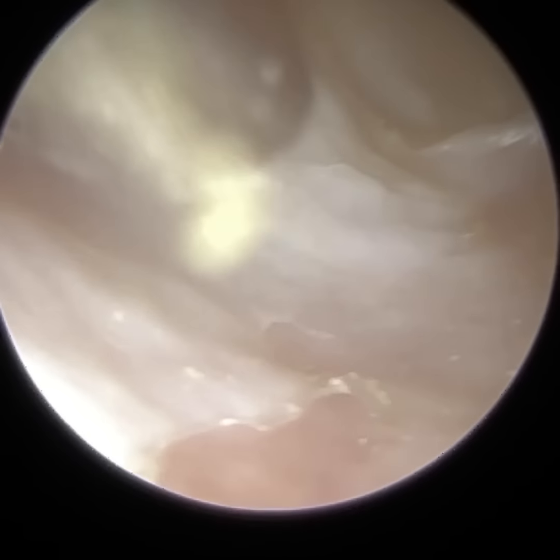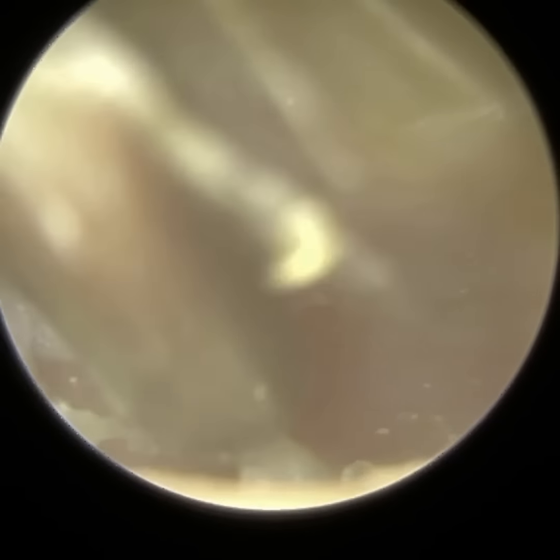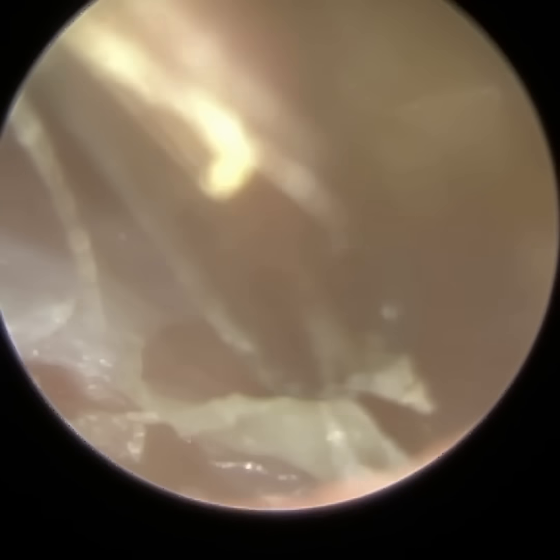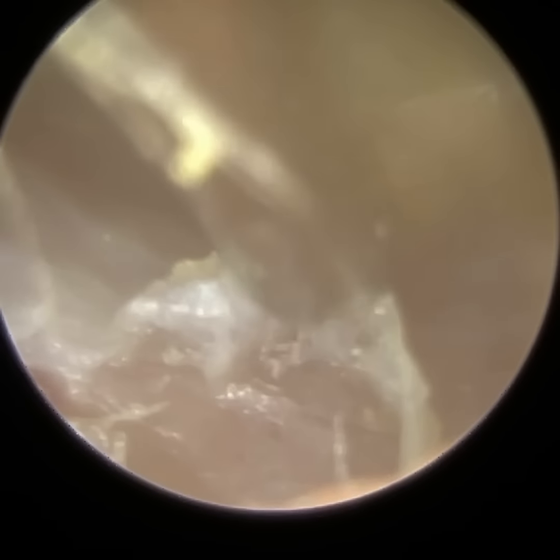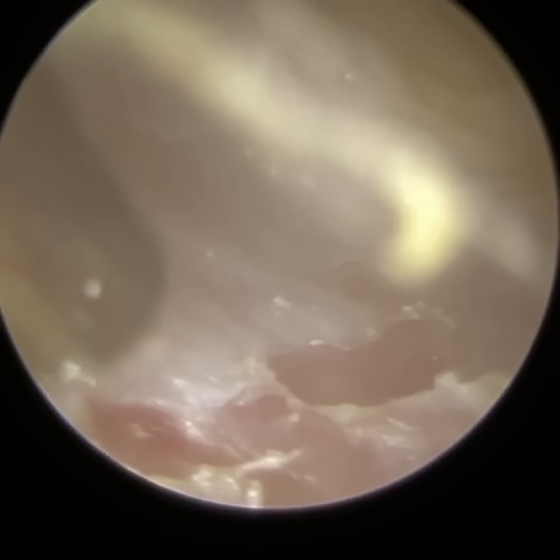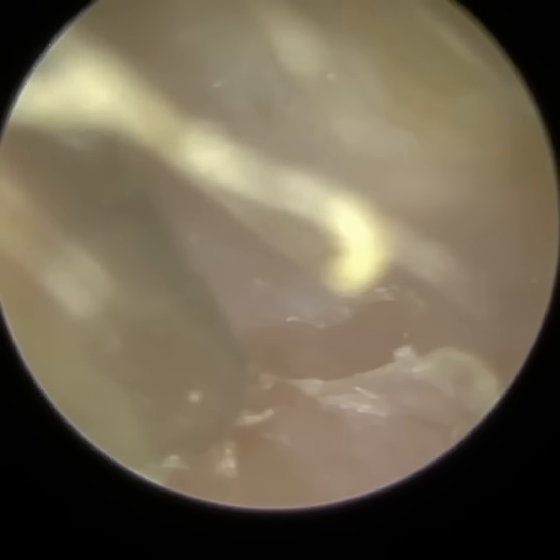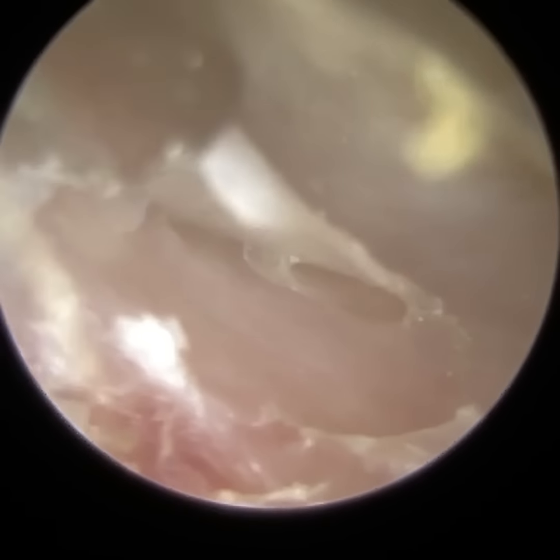So this skin here, this white layer of dead skin, if this is in my ear, it would naturally move sideways fully out of the ear, and the individual skin cells that are forming this sheet, this blanket, would separate. But here, it's not really migrating, it's not come fully away off the canal wall, and the individual skin cells are still interlinked.